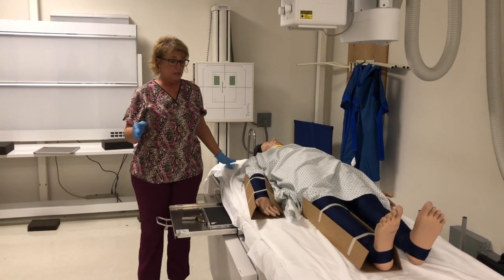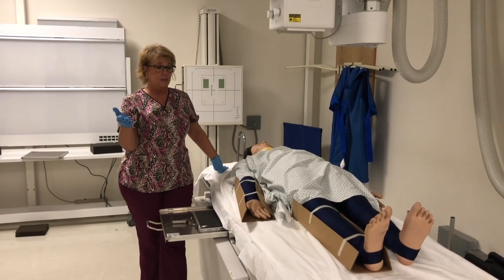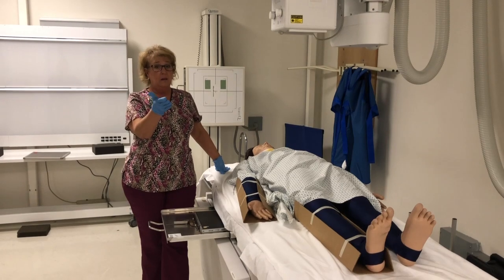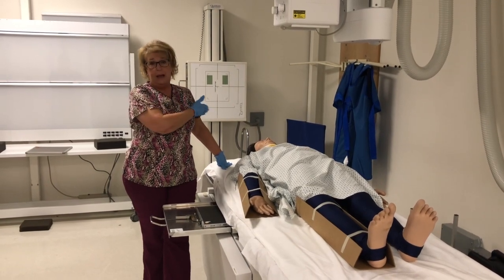So you also need to have a plan set up if you've got multiple imaging that you're going to do from head to toe. You typically want to do all of the AP from head to toe to start with, and then turn to your cross-table laterals and work your way back up.